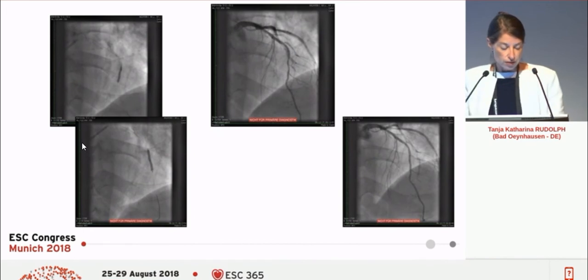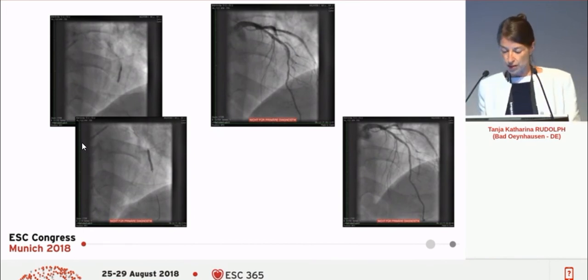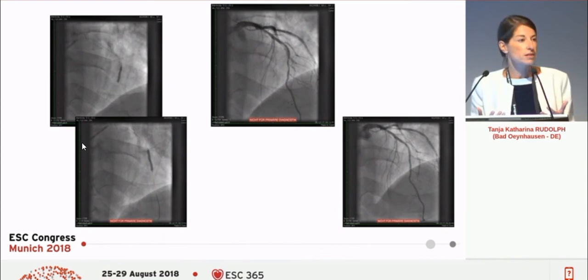So we decided to place stents here and to post-dilate. And here you see the angiographic result. And then what you should always do in such cases, because you still see it does not look perfect. Of course, it cannot, because you still see here it's still a little narrowing, and also the proximal part looks a little bit better because we had administered a lot of nitroglycerin and adenosine. But still, of course, this is a very badly diseased LAD. So just from the angiogram, of course, you could stent, I would say, even this part here as well. But do we really want to do this?